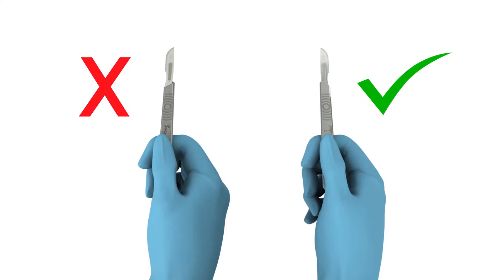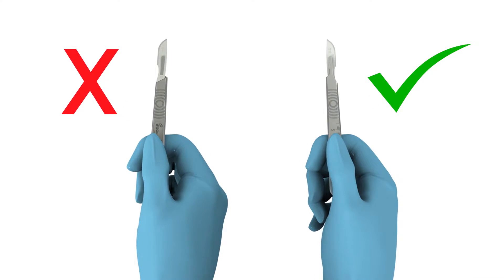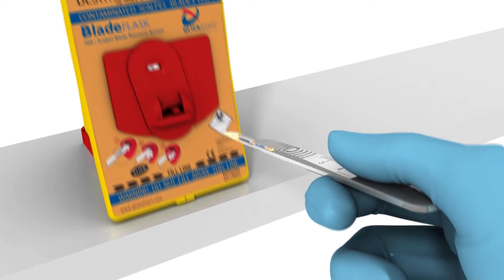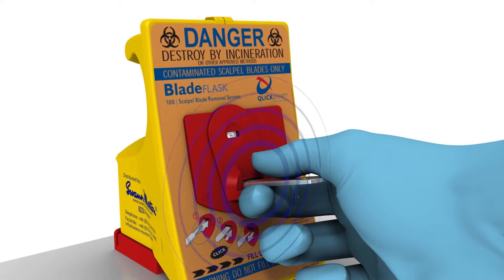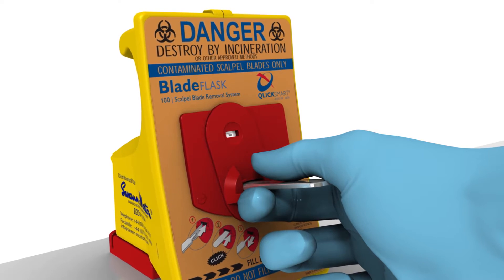To remove the blade, the scalpel must be oriented correctly, so that the sharp cutting edge of the blade is facing away from the body and to the right. Using one hand only, place the blade on the landing pad and push the handle all the way until you hear an audible click. The click indicates that the blade is removed and contained within the blade flask.